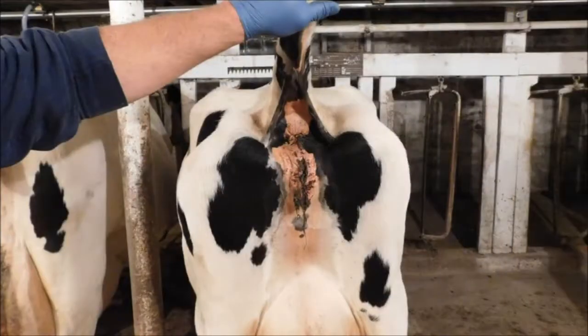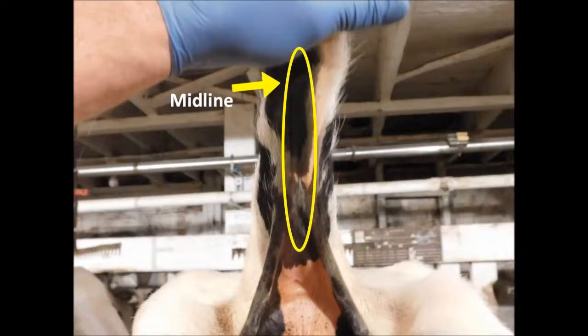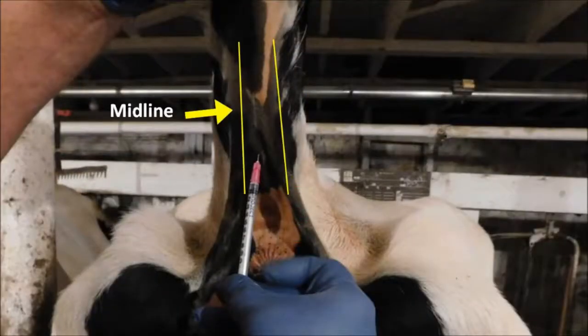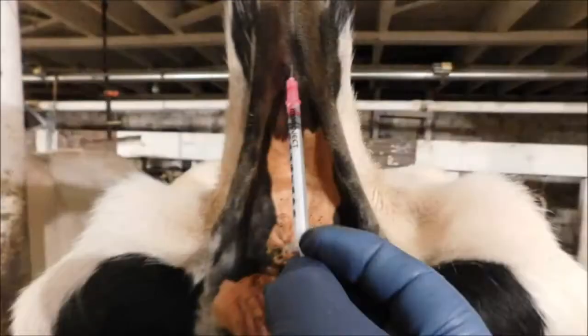To take a blood sample, lift the cow's tail vertically, exposing the underside, and identify the midline. Next, identify the soft area in between the hard bony vertebrae. Insert the 20-gauge, 1-inch needle perpendicular to the tail along the midline into the soft area between vertebrae. Pull back the plunger on the syringe to collect the blood sample. Only 1 mL of blood is needed.